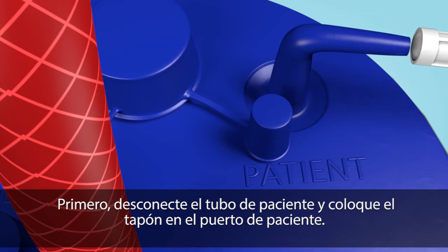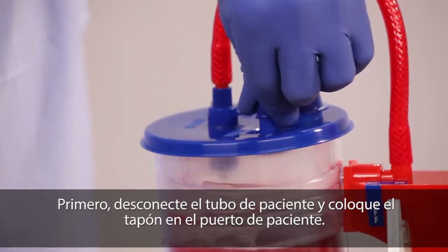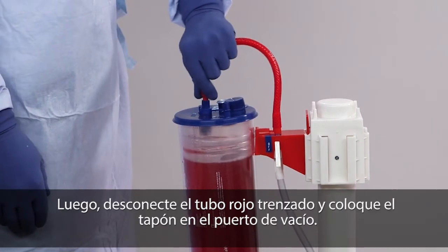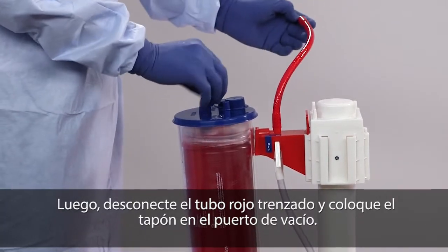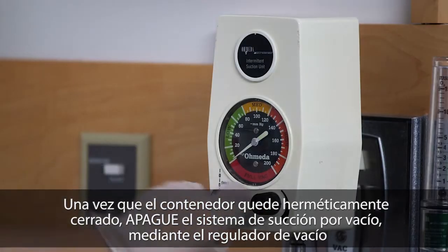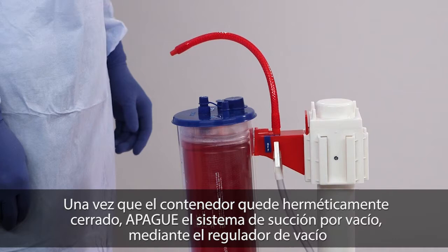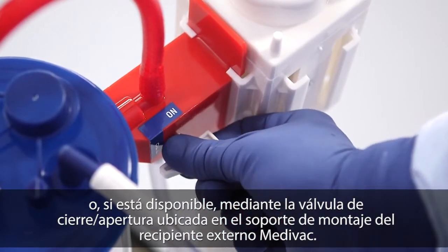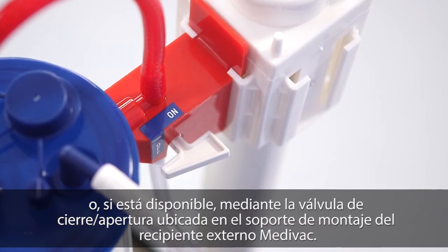First, disconnect the patient tubing and securely cap the patient port. Next, disconnect the red braided tube and securely cap the vacuum port. Once the liner is properly sealed, turn vacuum suction off using either the vacuum regulator or, if provided, the on-off valve located on the bracket of the reusable outer canister.